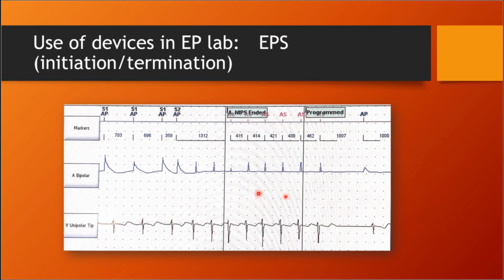Well, here we see that the tachycardia ended in the atrium without continuing, and it didn't end in the atrium with an atrial ectopic premature beat. It ended in the atrium with an atrial beat that came at the predicted time for the tachycardia with a similar morphology on the atrial bipolar lead to the previous beat. So it's very unlikely to be a premature atrial beat. So this is highly unlikely to be atrial tachycardia. So what do we have here? Let's move on and have a look.